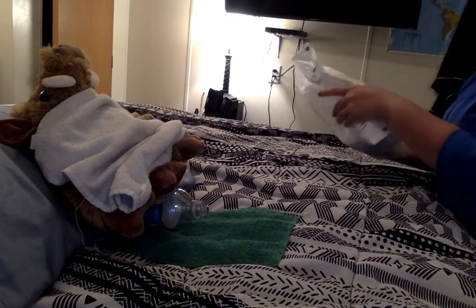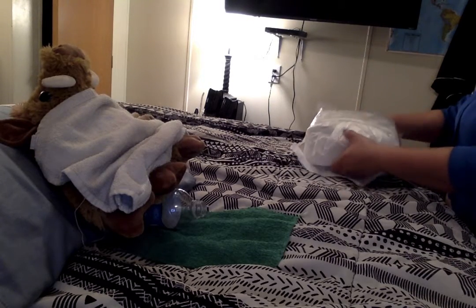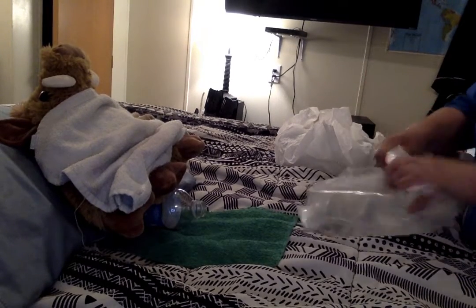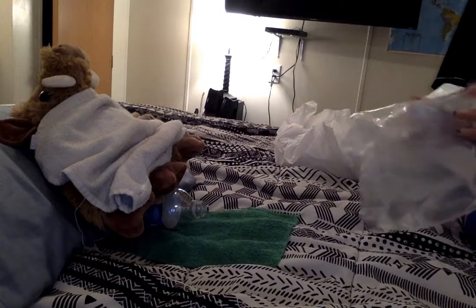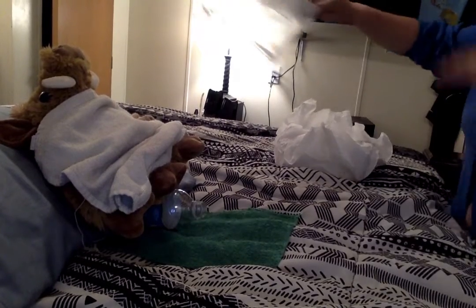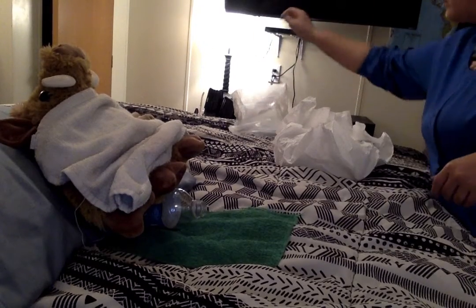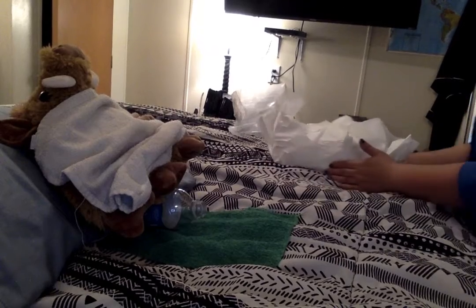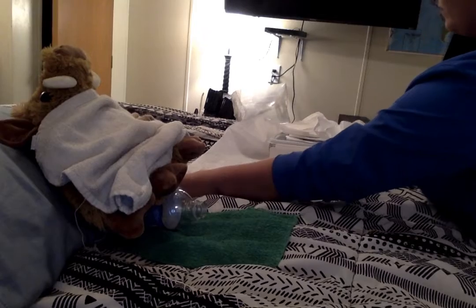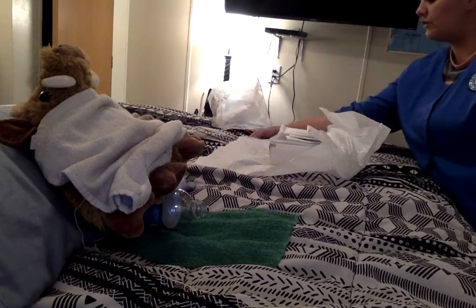So we are going to tear it open and get it out of its package. We are going to take this plastic bag and turn it into a trash can. We're going to put this at the end of the bed, facing up, so that we can just throw stuff in there. Next we're going to grab our catheter kit. We're going to start by opening it on the farthest side away from us, making sure not to contaminate our sterile field.